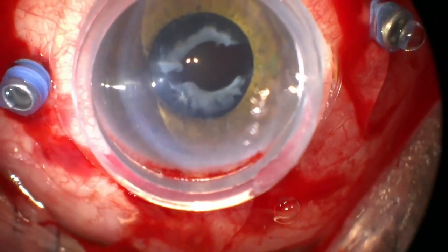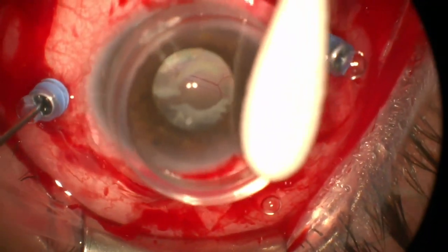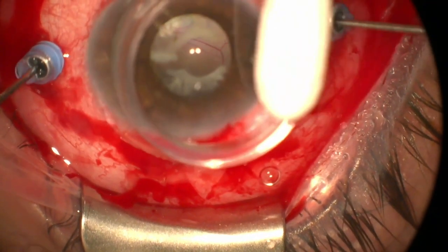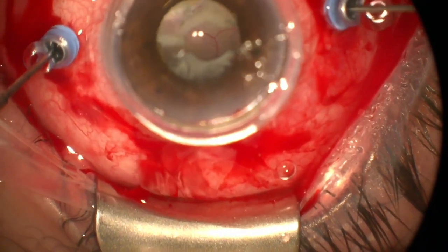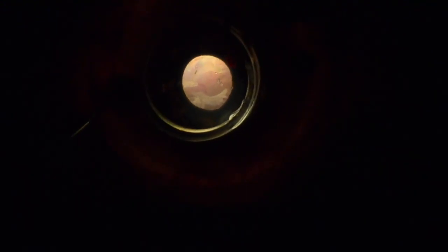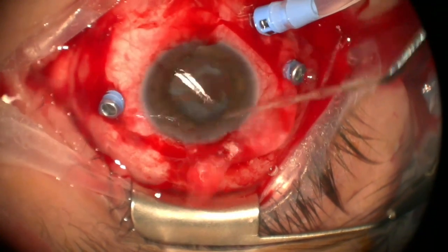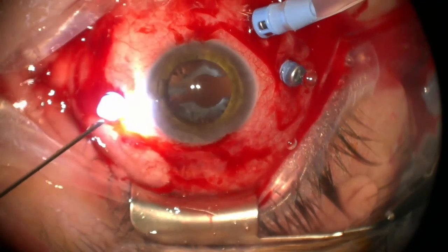We go to a contact lens here to get a better view. And let's see what we got here. Oh, the capsule may interfere a little too much. Yeah, I think it does. Let's take out more of the capsule. Yeah, the capsule's obstructing us a little bit here. So we're going to have to do a little work on that capsule piece to get a better view. And it'll just take us a couple minutes, I think. It won't be that bad.